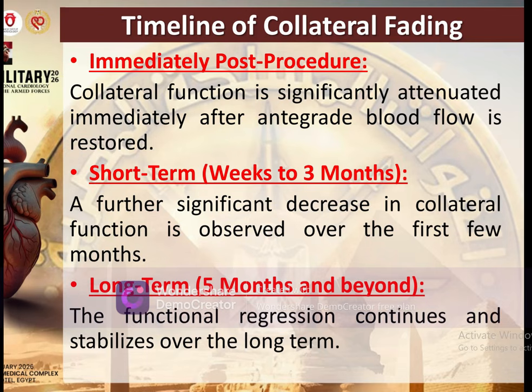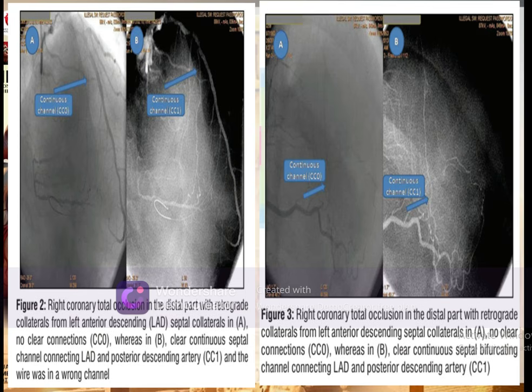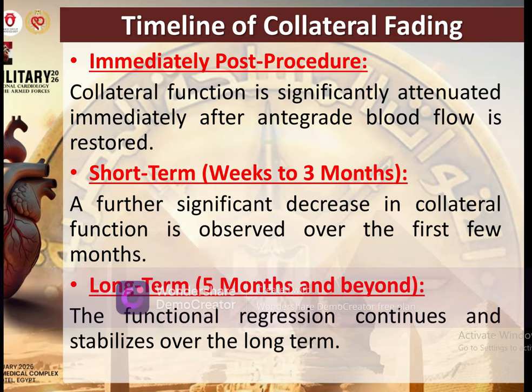As we see here, if you use a regular angio, you couldn't demonstrate the channel well, but after inverting the grayscale with some modification of the characteristics of the picture, you could demonstrate well-formed and straight connecting channels. You could use it as a roadmap, and you go direct surfing these channels particularly, and I think it will lead to the distal target vessel.